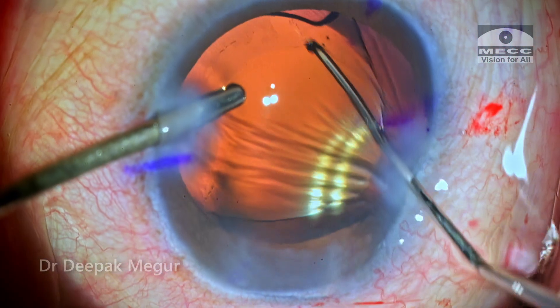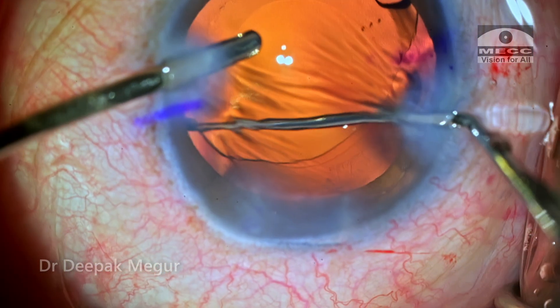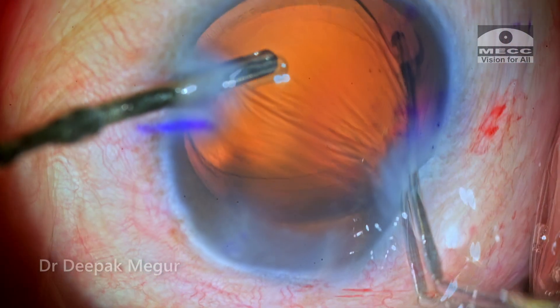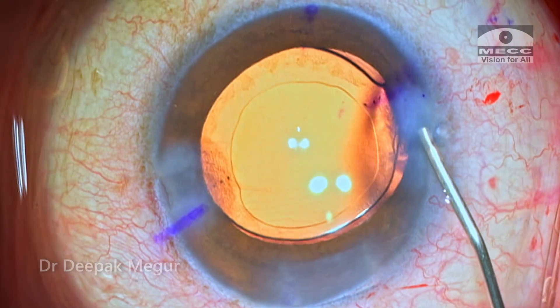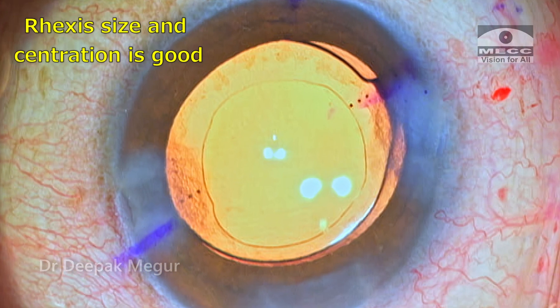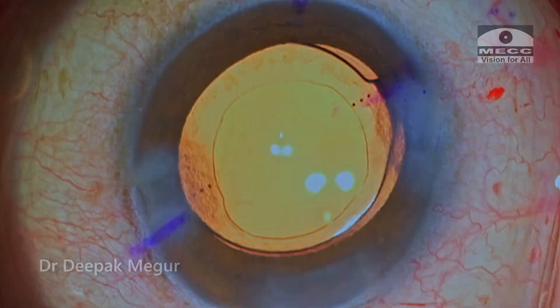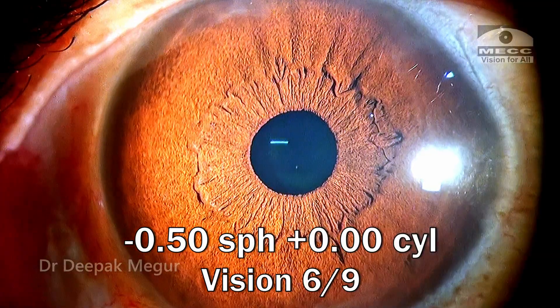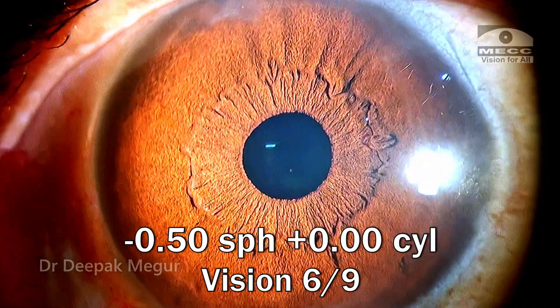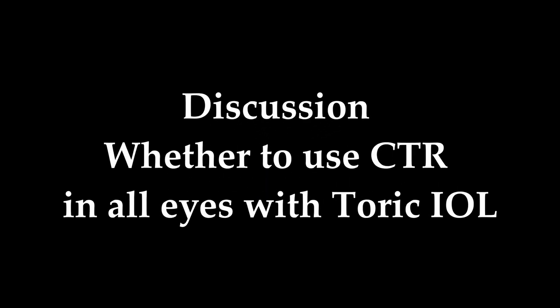Time to align the lens. Before closing, I think it's time to just review the size and centering of the rhexis — it looks alright. In these myopic eyes, getting the right size rhexis is challenging, and it looks alright, although it's slightly eccentric, but should do the job well. These are the post-operative pictures and the refractive outcome: the residual refractive error is minus 0.5 spherical, there's no cylinder at the end of 15 days, and the patient is quite happy with this.